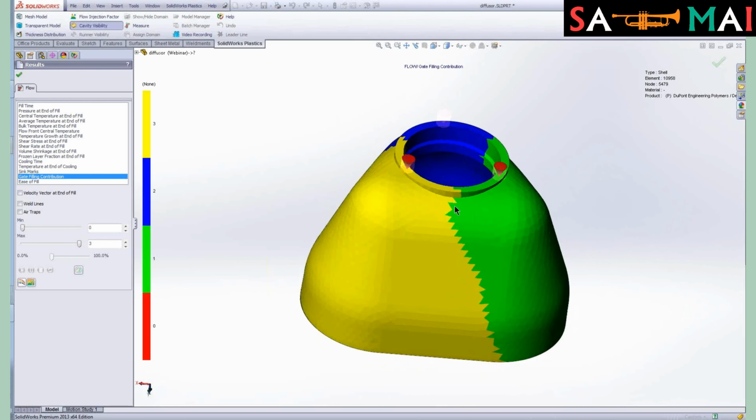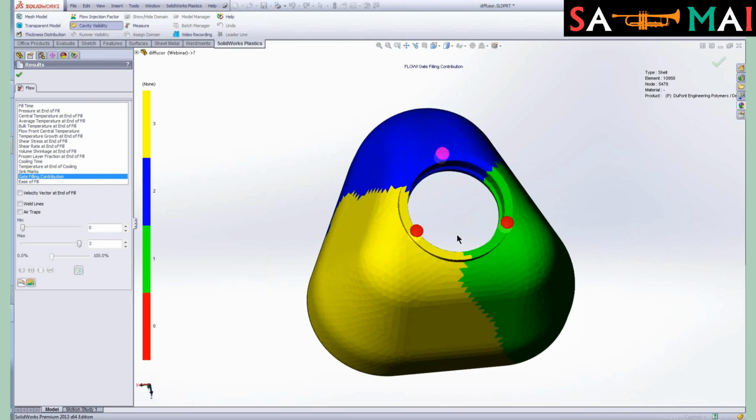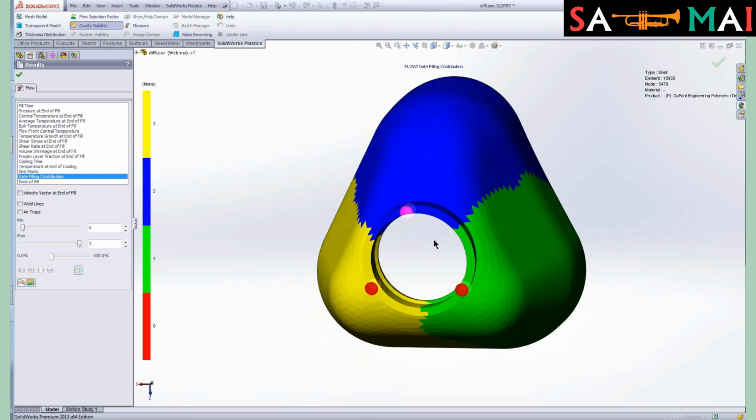Now you notice that this isn't quite symmetric. The reason for that is I'm using a shell mesh, not a solid mesh, so that is going to throw off our results just a little bit. If I were to switch to a refined solid mesh, you would see that this flow front would be much more symmetric, like we would expect.